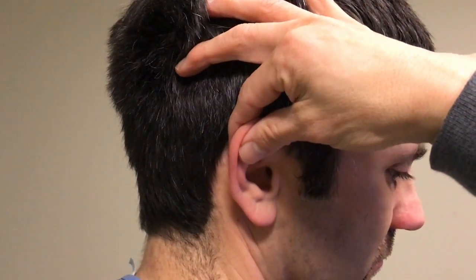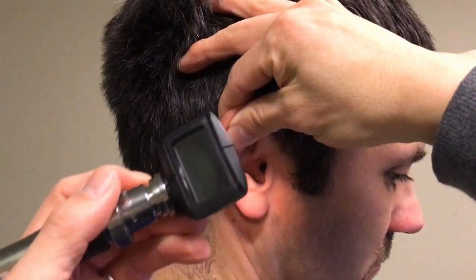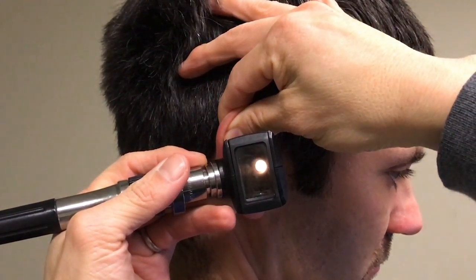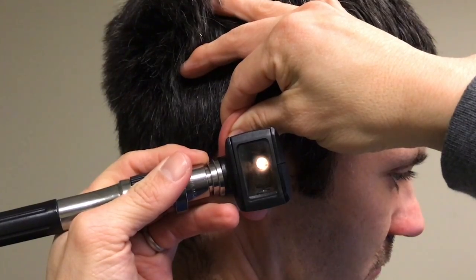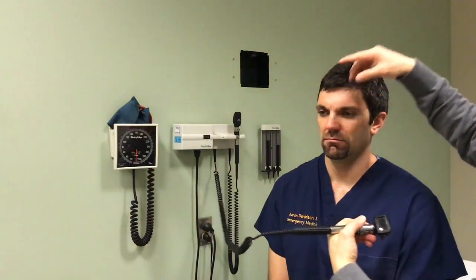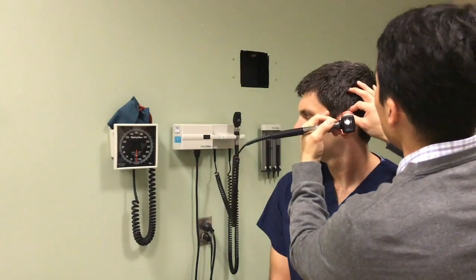Next, pull up and back on the patient's auricle with a non-dominant hand as you gently insert the speculum into the canal. Inspect the canal for any cerumen, foreign bodies, or discharge. As you insert the speculum further, you should observe the tympanic membrane, including the cone of light and the malleus. Repeat with the other ear.